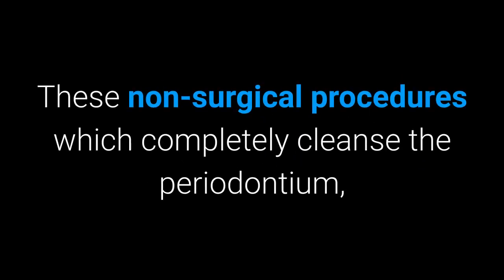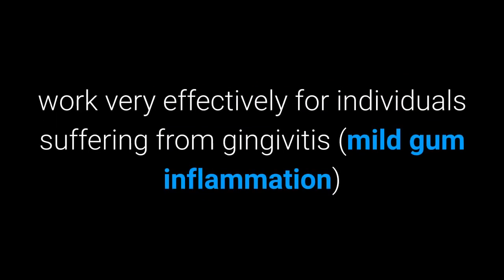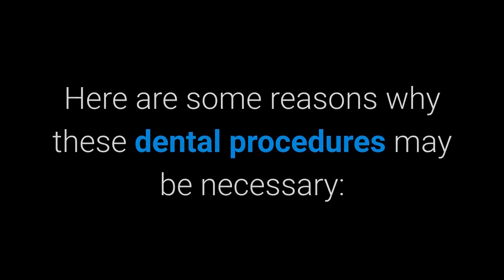These non-surgical procedures, which completely cleanse the periodontium, work very effectively for individuals suffering from gingivitis, mild gum inflammation, and moderate-severe periodontal disease. Reasons for scaling and root planing. Scaling and root planing can be used both as a preventative measure and as a standalone treatment. Here are some reasons why these dental procedures may be necessary.